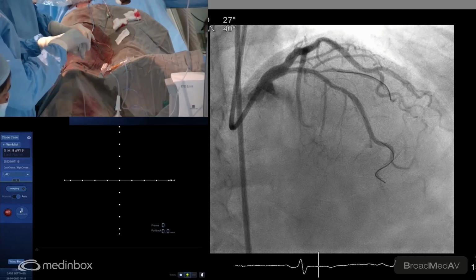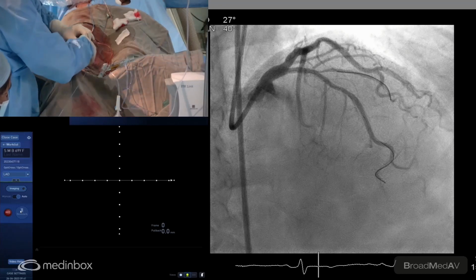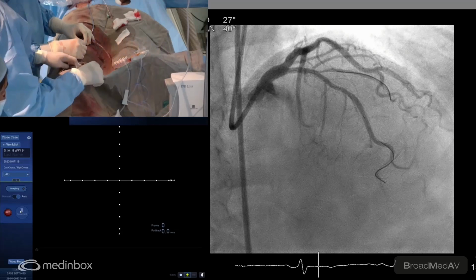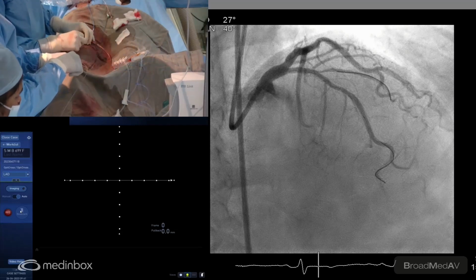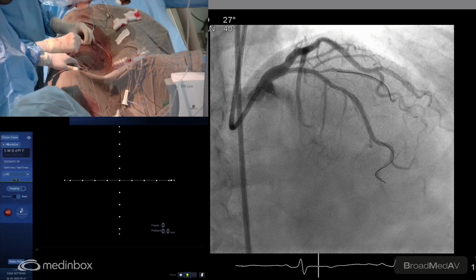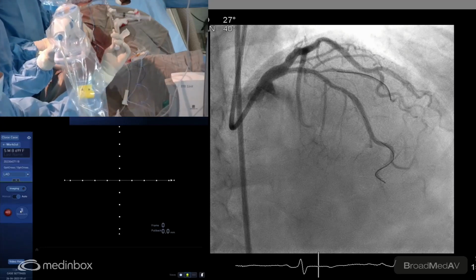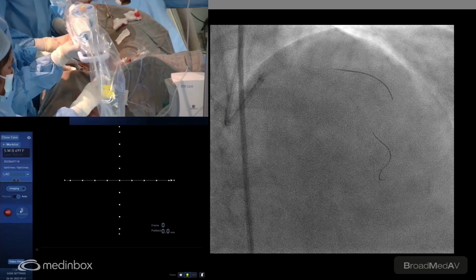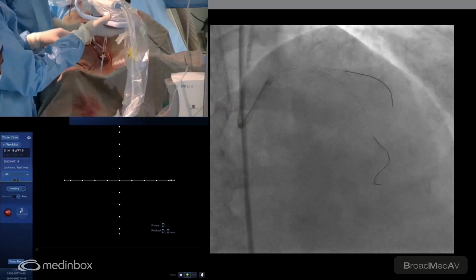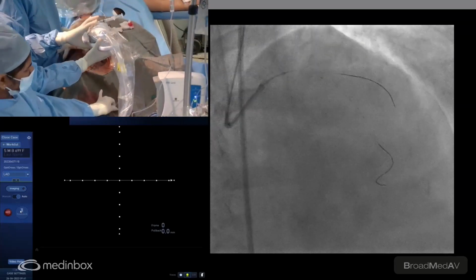So as much as possible, unless it's a very big vessel, we do a provisional strategy in our hospital. We use a 2 stent strategy only in case we have a large diagonal or circumflex with ostial disease extending into the origin beyond 10 millimeters. In this patient, I expect that the diagonal is about a 2 millimeter vessel, so we would not possibly go ahead and do too many things unless we pinch it during the procedure.